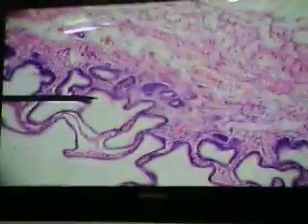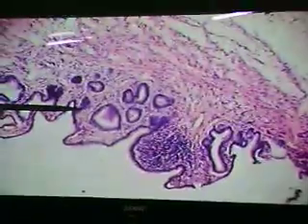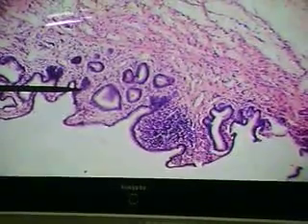Now what can we say about the gallbladder? There is a mucosa, and this mucosa looks honeycomb in shape, giving you the appearance of glands when there are really no real glands there. It is described that in the lamina propria, just at the neck of the gallbladder, we may encounter some mucus-secreting glands, and also going into the bile duct. But generally speaking, the gallbladder is devoid of glands.